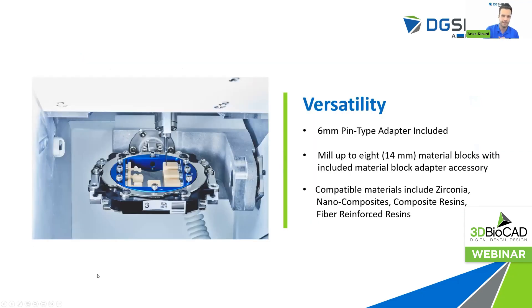Versatility — as always, our machines are proven to be one of the most versatile milling machines in the world, and the DWX 53DC is no exception. We're still including the six-millimeter pin type adapter. If you're looking to mill your pin type material blocks — your dry mill, softer blocks — compatible materials include zirconia blocks, nano composites, composite resins, fiber reinforced resins, and things like that. You still have the ability to mill up to eight of those material blocks at the same time.